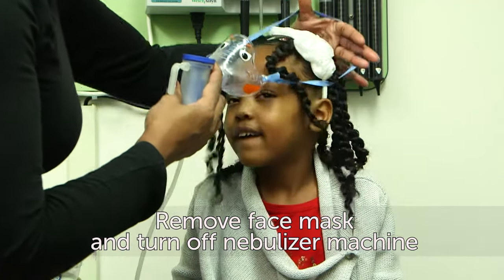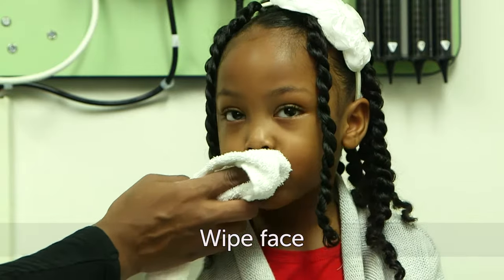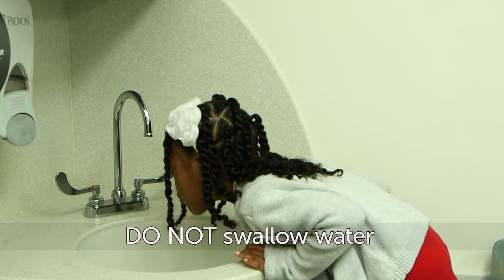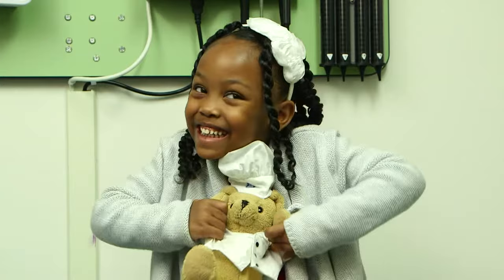Remove the face mask and turn off the nebulizer machine. Wipe your face and rinse your mouth out with water. Be sure to spit the water out — do not swallow it. You're all done. Good job.